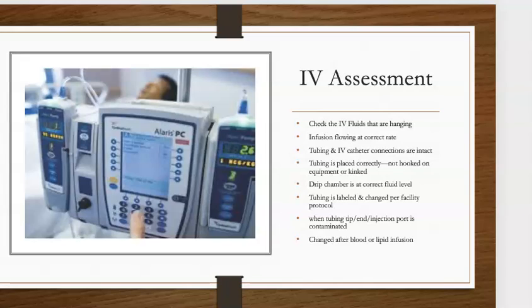Okay, so I want to cover a couple slides on our first lecture. I want to talk about IV assessment. Please remember iTrace, okay? Anytime you have anything hooked up to your patient, you need to be going to the point of origin, following it back.